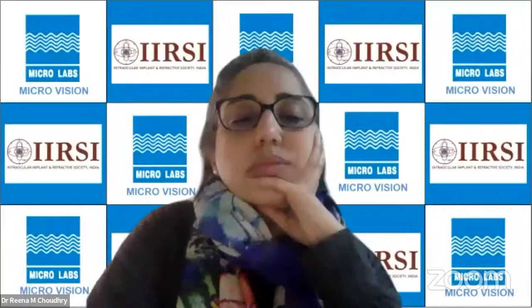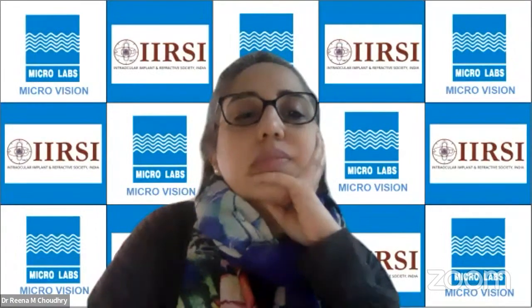But I think the best time period or window for these kind of needlings, at least in my hands, has been between 6 months to maybe at the most a year, not longer than that. Much longer than totally scarred areas. I think you can sort of try something, but you know in your heart of hearts that it's not really going to lift up the bleb and so on.